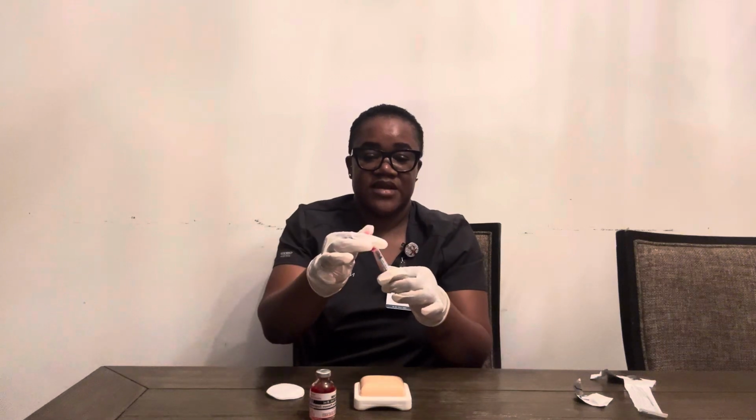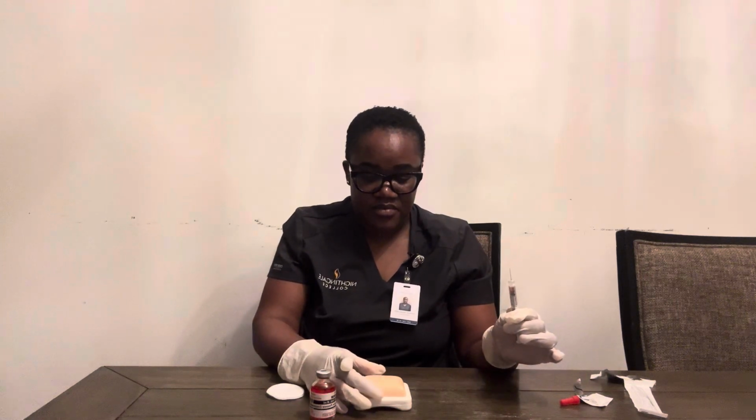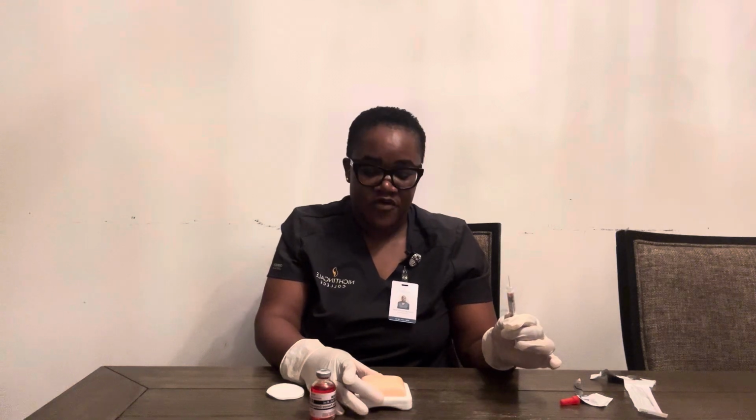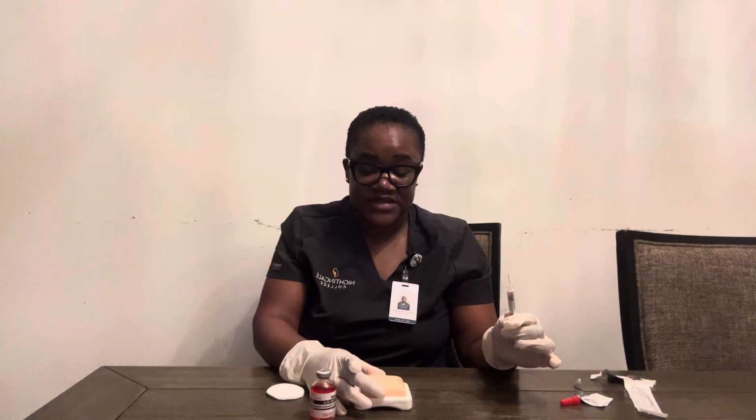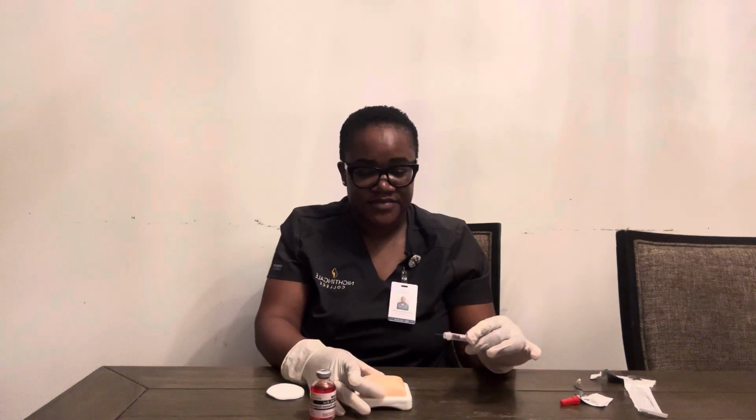I'm gonna uncap my needle, and for the site, I'm gonna pull on the skin around the site, making sure it's nice and tight.